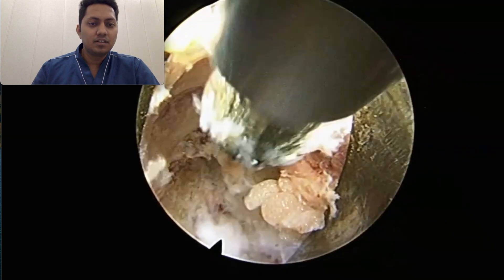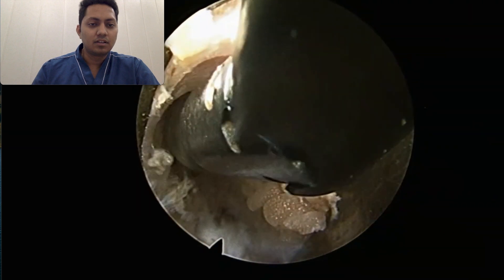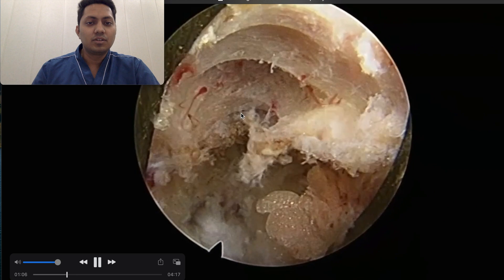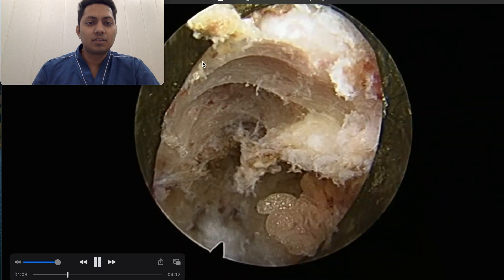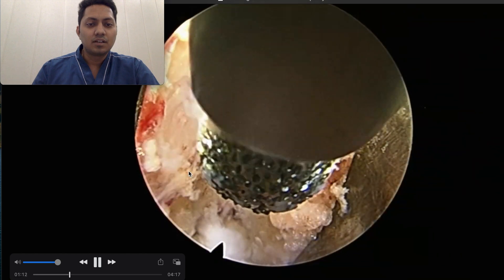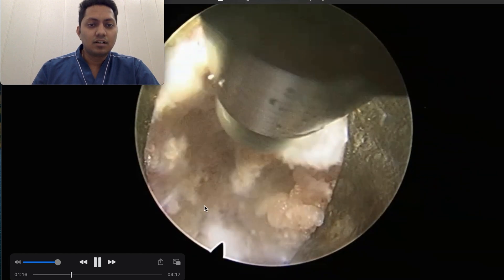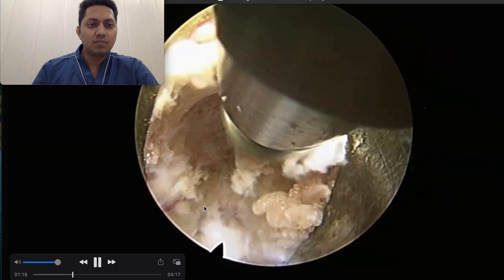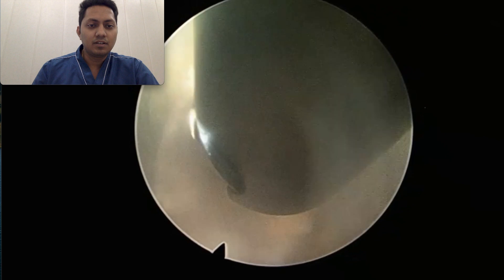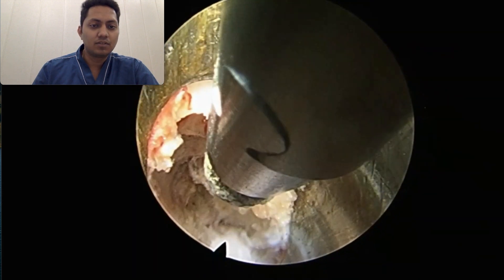This is a tedious job but it gives very good results in terms of the exposure we can get. You can see we have already started removing the extra-articular part of the superior articular process. This is the disc space, and with a C-movement from right to left we can smooth out that area of the superior articular process.